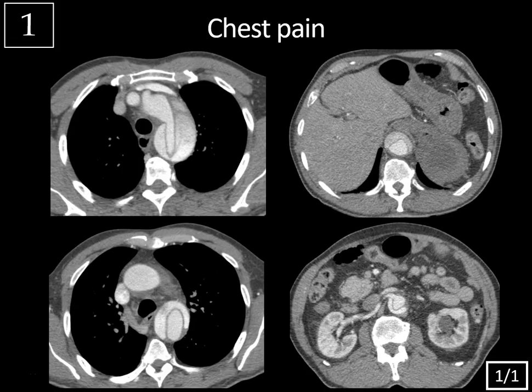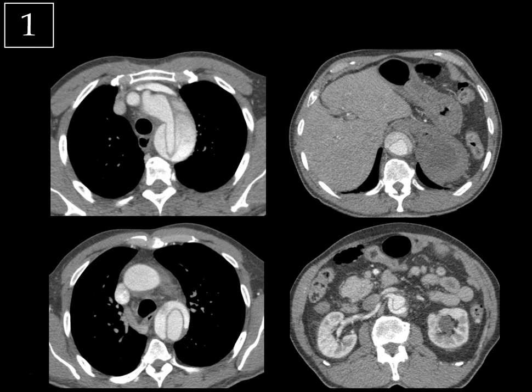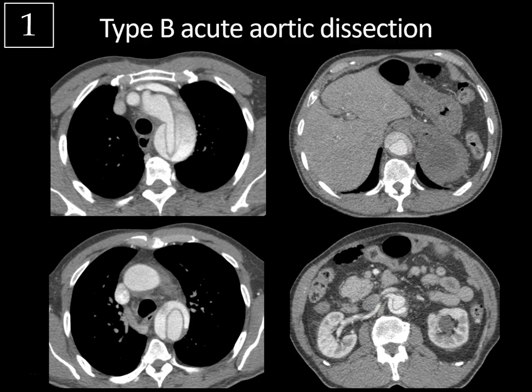Case 1: CT angiogram chest and abdomen. Here you can see an intimal flap within the aortic arch continuing into the descending thoracic aorta into the upper abdominal aorta to at least the level of the right renal artery, and this is typical for a Stanford type B acute aortic dissection.